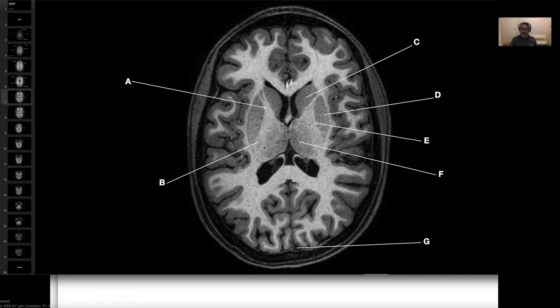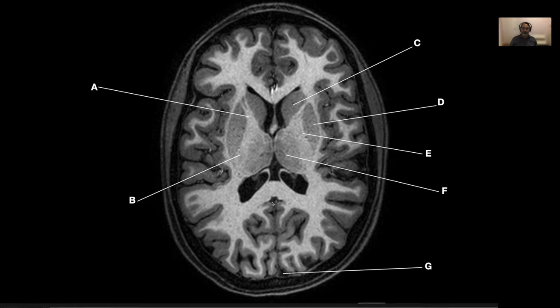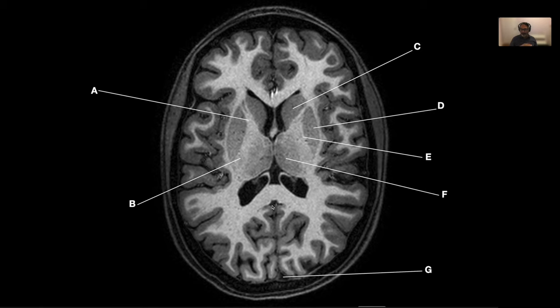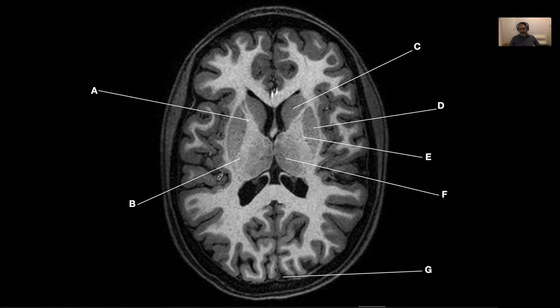And now that we're talking about that, it is going to be your turn to tell us. Now we're one level lower. So we did this, now one level lower. From the image, let me take you. So where we are now is here. We're at this level. Okay, so yes. Correct, but it is the anterior horn of the internal capsule. Or anterior limb, not horn, sorry. Anterior limb of the internal capsule on the right.